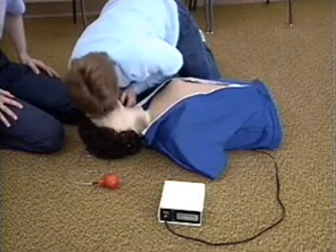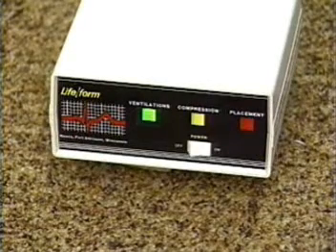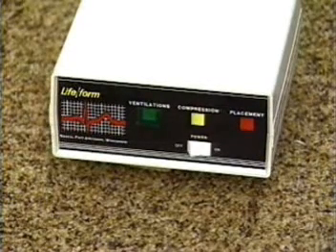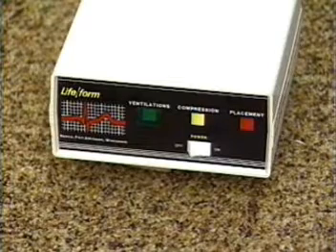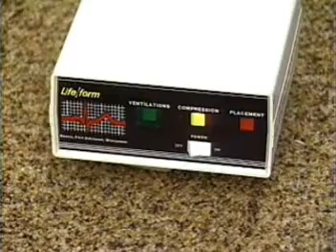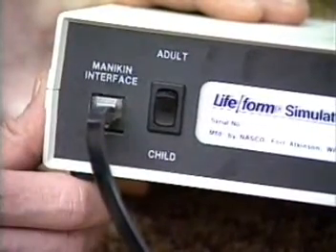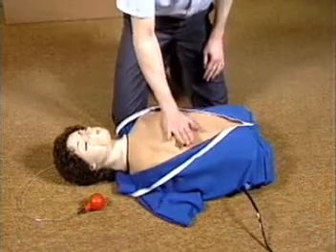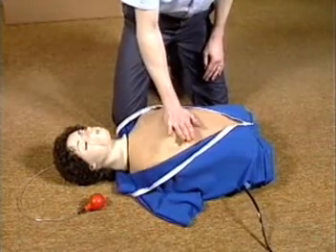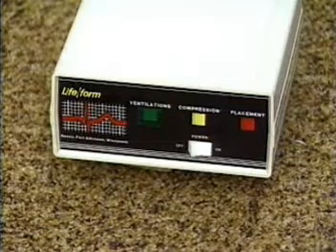When using the light controller with either the mannequin or torso, the green light will signal proper ventilation volume, the yellow light will signal proper compression depth, and the red light will signal improper hand placement during compressions. With CPARLENE in the child mode, the levels at which the lights operate will automatically change to reflect the levels established in the American Heart Association Standards and Guidelines for Child CPR.